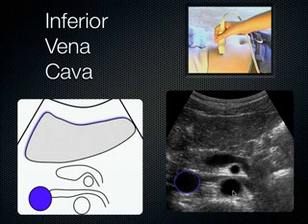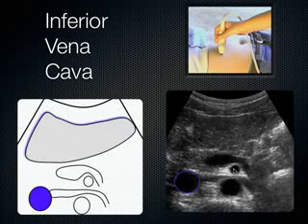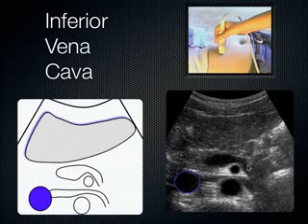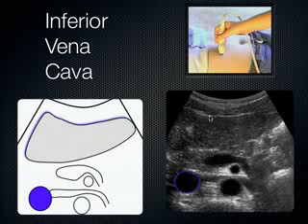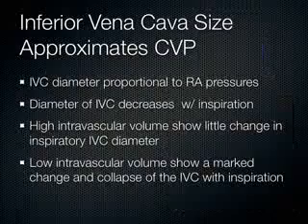What's this? Good. What's this? What's this? What's crawling over the SMA? Splenic vein. Very good. What's this tissue out here? Pancreas. Liver. And what's getting nut cracked here? Left renal vein dumping in the IVC. Very good. Okay. Cool? Now let's talk more about the IVC.